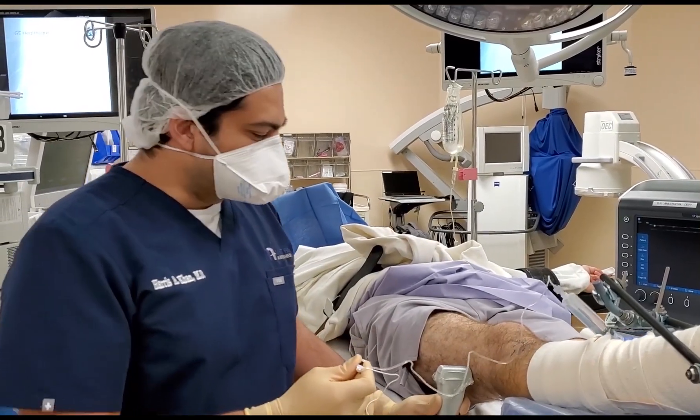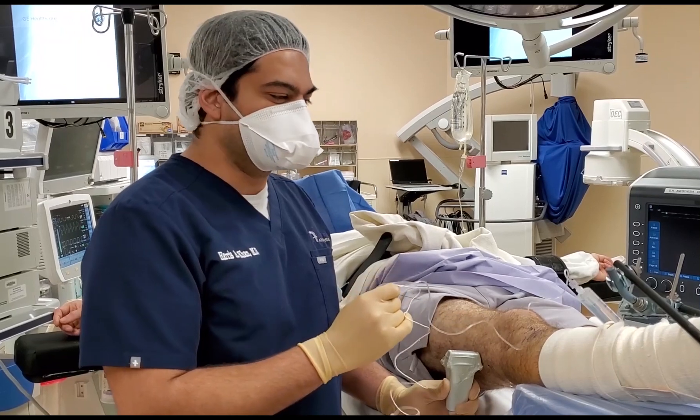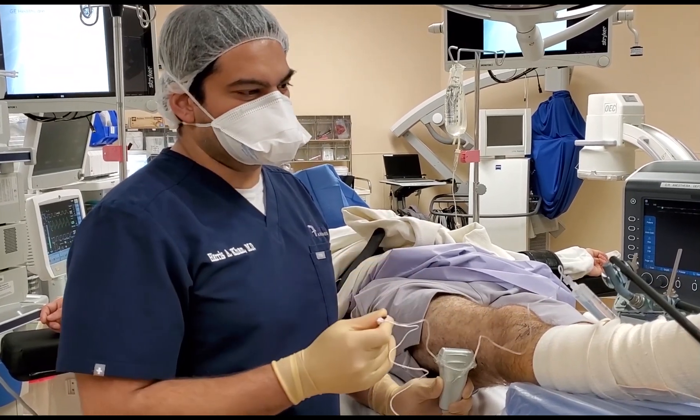Hi guys, this is Dr. Khan again with Metro Anesthesia. Today we're going to be doing a popliteal and a saphenous nerve block for a patient who's going to be getting surgery on the ankle.